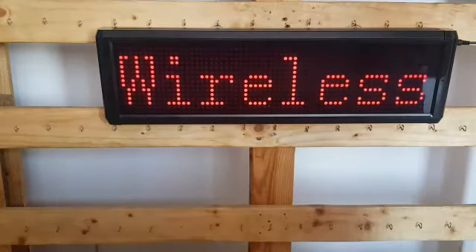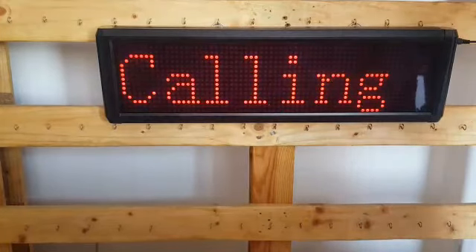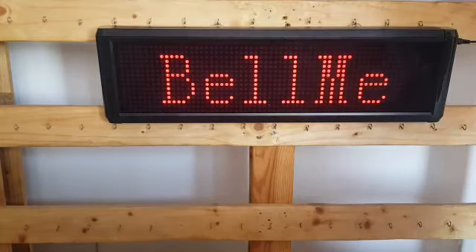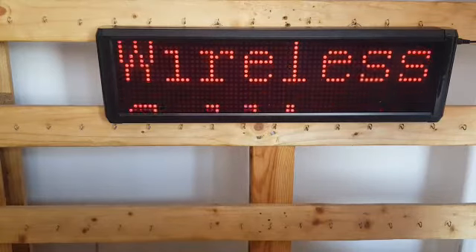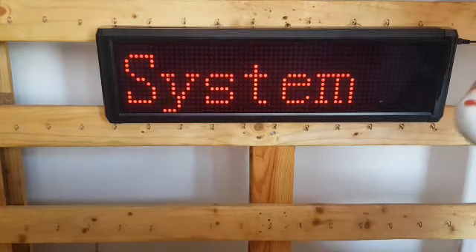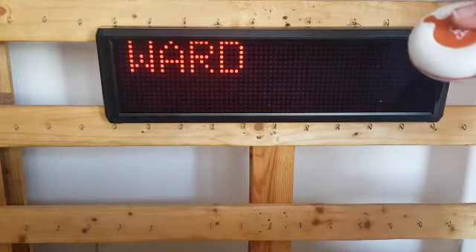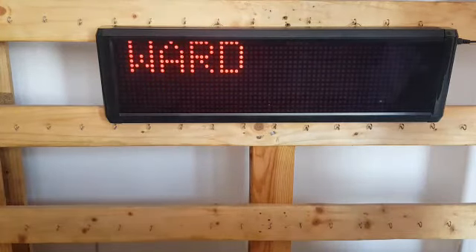In this video, I will be showing you how you can change the number of calls it shows you at a time on your B900 display panel. So the default setting is 4, but you will notice it becomes a problem if you have more than a few characters to display your information. So for instance, this button is meant to show me Ward 2 B13, but it only cuts off at the D because it is set to only show 4 calls at a time.